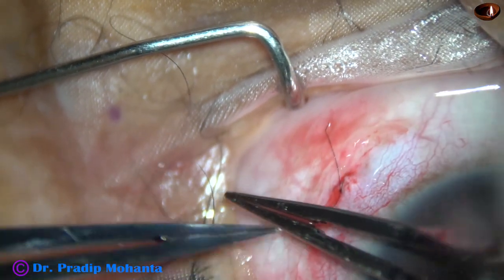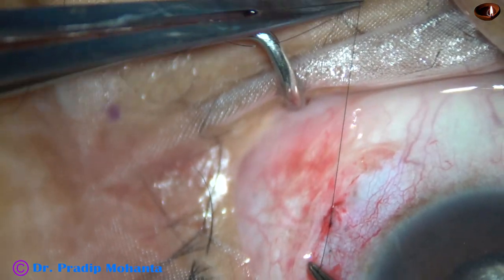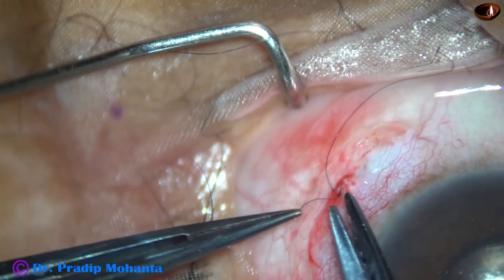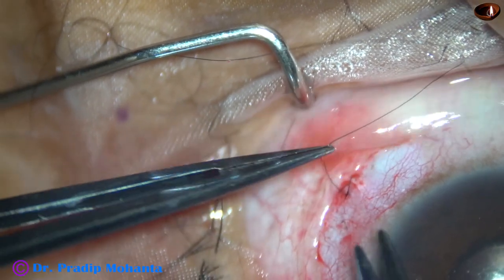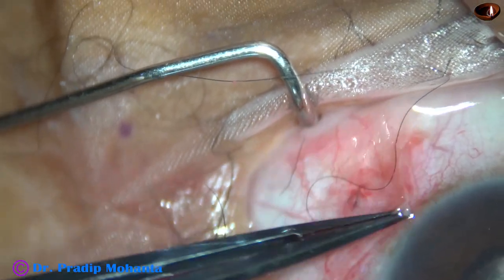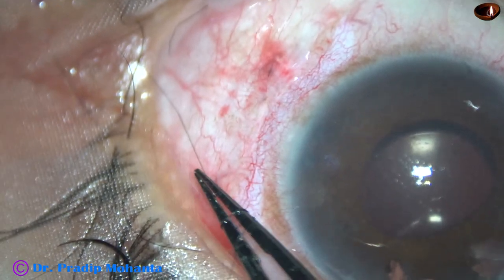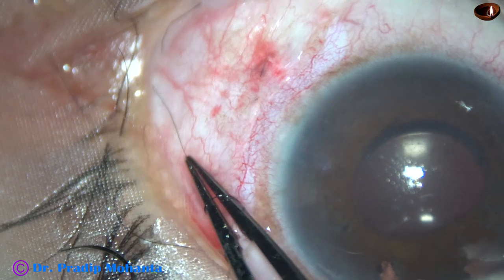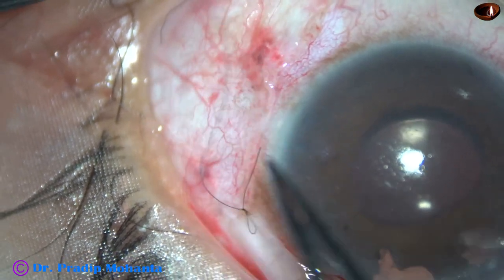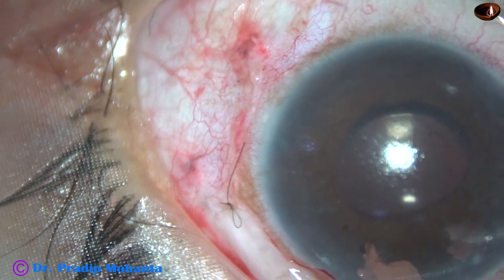All sclerotomies were closed with 10-0 nylon. The conjunctiva was reposited and releasable sutures were used to keep it in position. For the releasable suture technique: just three loops, pull the thread, and cut. I have many videos on releasable sutures for further reference.